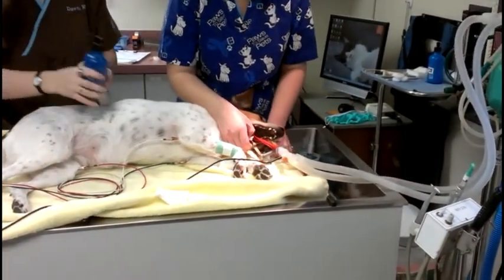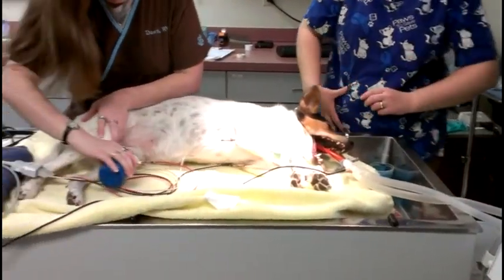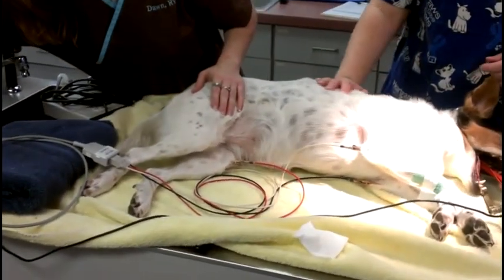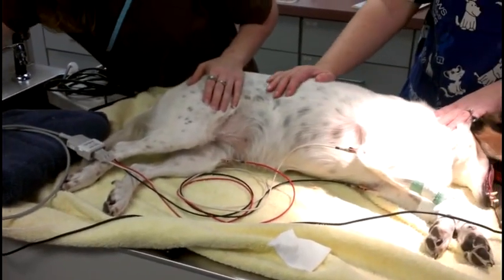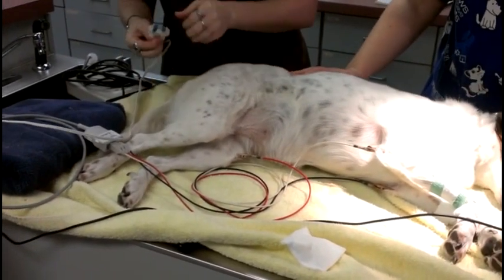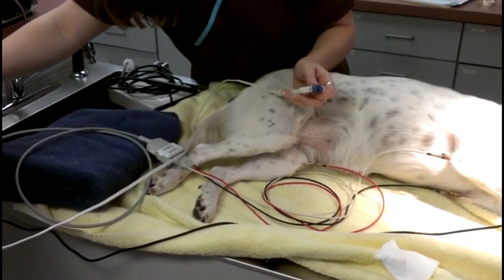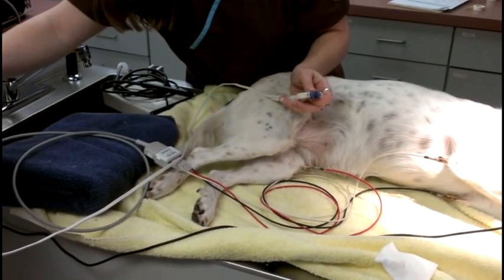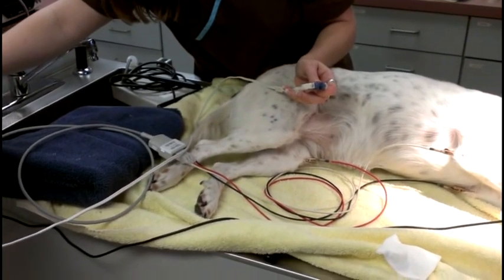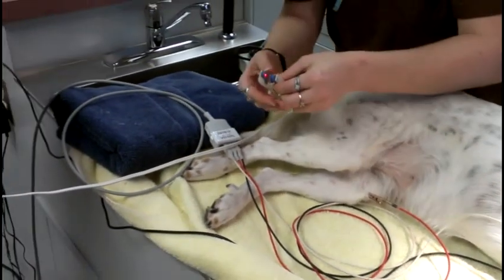Once they're under their anesthesia, the next thing we do is we hook up all of their monitoring equipment. Dawn is hooking up the ECG, and that'll monitor her heart rate and her heart rhythm while she's under, so we can make sure everything is nice and healthy. And then we have a respiratory monitor hooked up, and that just keeps an eye on how much she's breathing per minute. Make sure that that's good. And then we'll also put a pulse oximeter on her foot. And that'll tell us how oxygenated her blood is.